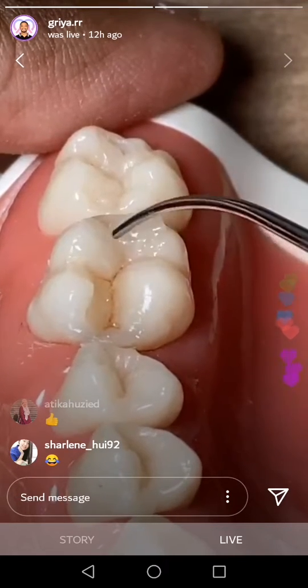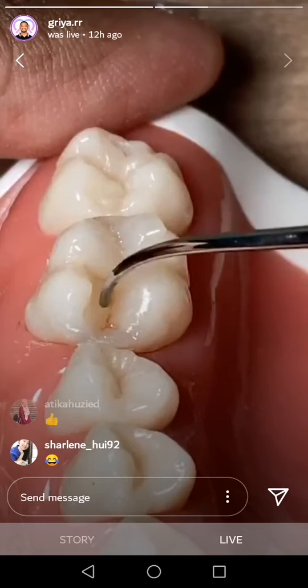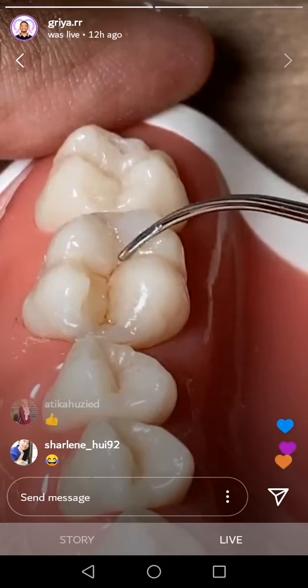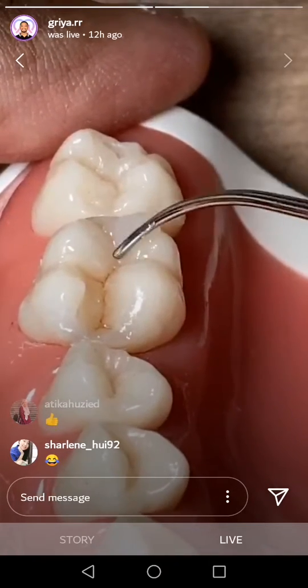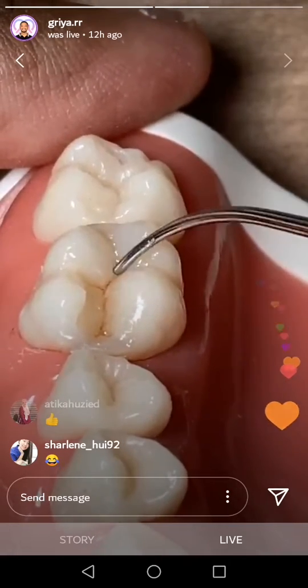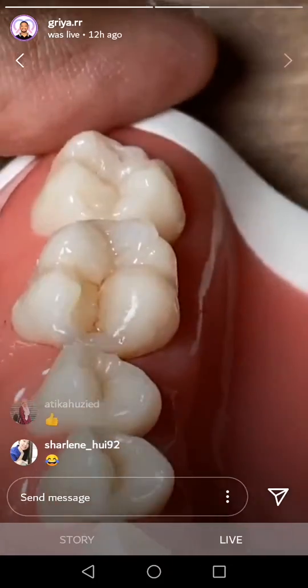Step. Don't do like this. This is wrong. Not following this. You need to follow like this. Stop. Like that, only like that. Very easy, right? And see, the excess will show. Okay, that's fine.